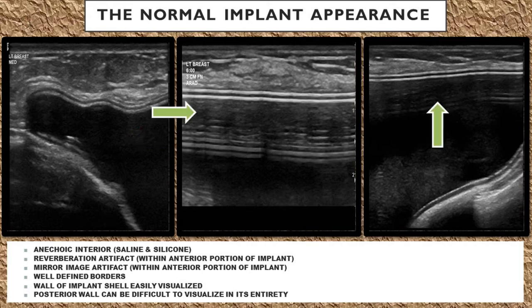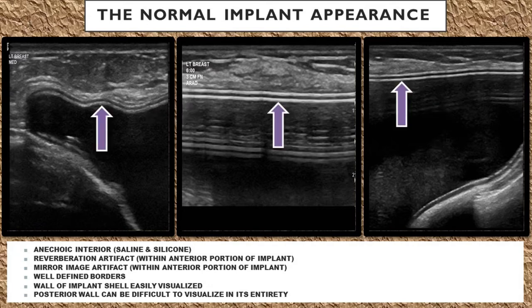You'll see reverberation artifact within the anterior portion of the implant, from the highly reflective implant shell wall. There's also going to be mirror image artifact within the anterior portion of the implant, also due to the highly reflective implant shell wall.